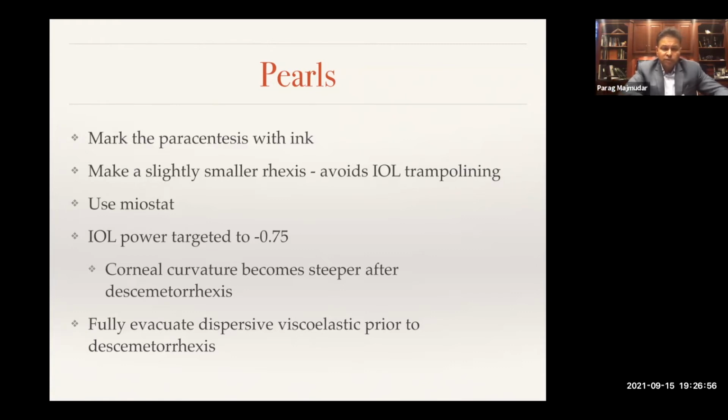And if you've already used phenylephrine before, you've kind of already saturated most of those receptors. Adding more phenylephrine is not going to give you as much of an effect. So a lot of times we'll see when I just use tropicamide and then I use intraocular epinephrine, then I'm going to get a real nice pupil, but it also responds well to Miostat or Miochol when I'm ready to do my DMEK. So we'll talk about that.